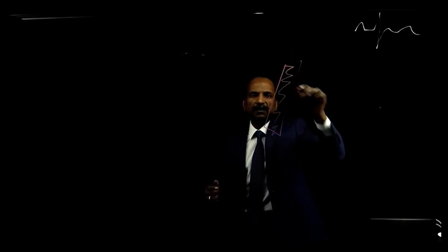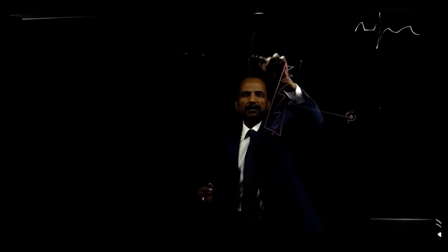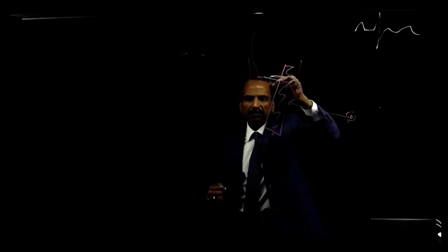So maybe I'll just add to that, Siva, that when we do a quick map, a fast multiple-electrode map, and we're pacing from this side, while we're doing that map with whatever we're using, if some of the electrodes pick up a signal on this side of the line, then the whole map becomes very difficult to interpret. Because then you'll have something here that will get interpolated to being something earlier than this side, and it will look like it's conduction when it may not be. So it's a tough thing.